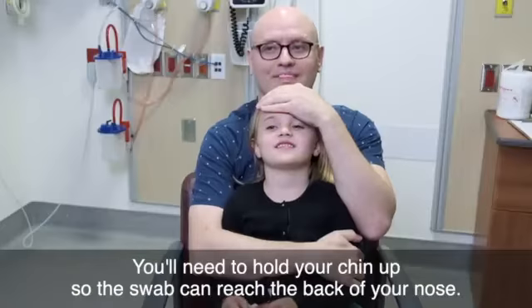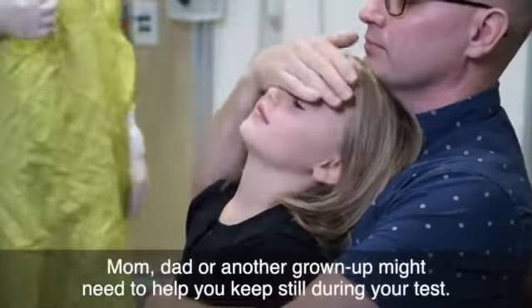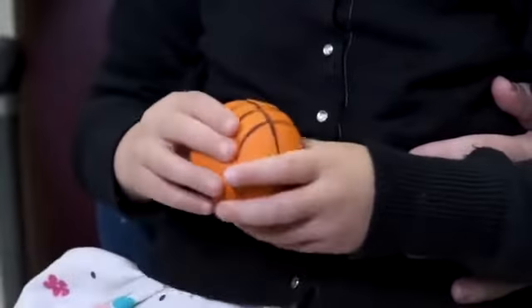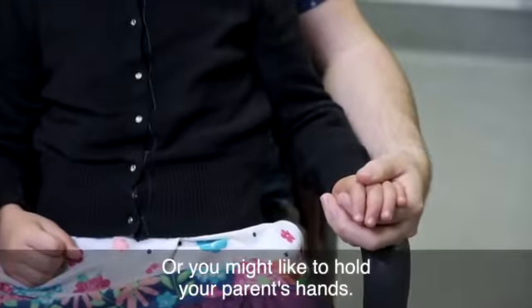You'll need to hold your chin up so the swab can reach the back of your nose. Mom, dad, or another grown-up might need to help you keep still during your test. You might like to plan what you want to do with your hands. Some kids like to hold a squishy ball or their favorite stuffed animal, or you might like to hold your parents' hands.